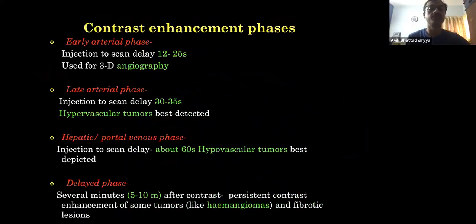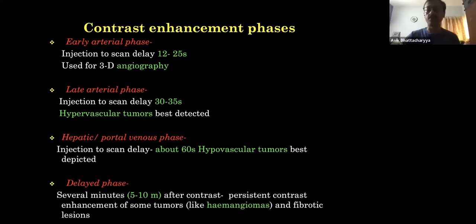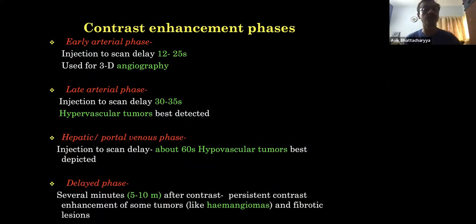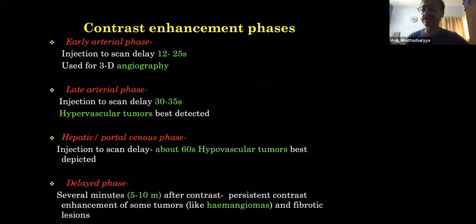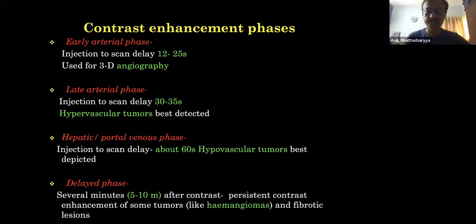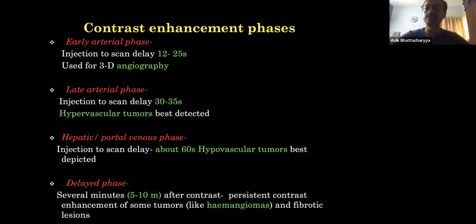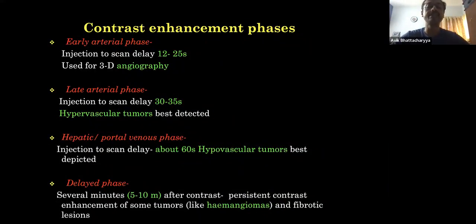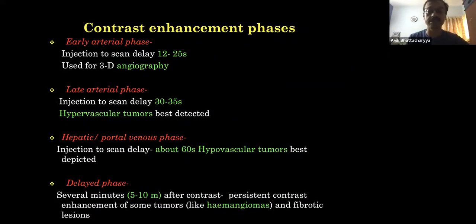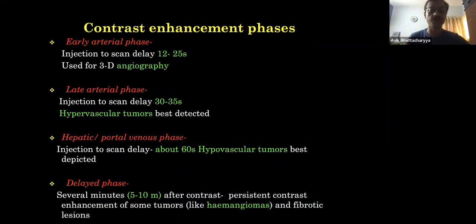Okay. So as it was a class for a triple phase CT scan of abdomen, we need to first figure out what does it mean. What does it mean, a triple phase CT scan? Or it is also called multiphasic CT scan. Actually, different structures of our body and different pathology of our body enhance in different time intervals when we see a CT scan or contrast enhanced CT scan of either thorax or abdomen of our body.